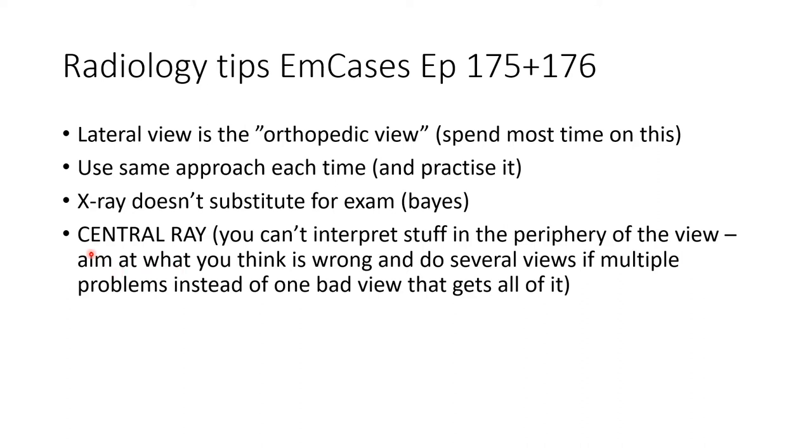Central ray is really important. The center of the X-ray should be the thing that is most important. Don't try to skip x-rays just because you want to spare them. If you really think they have a fracture, especially in the forearm where there might be a Galeazzi or Monteggia fracture, then you should x-ray the parts that you need to.